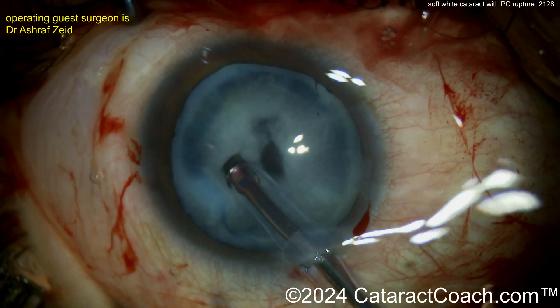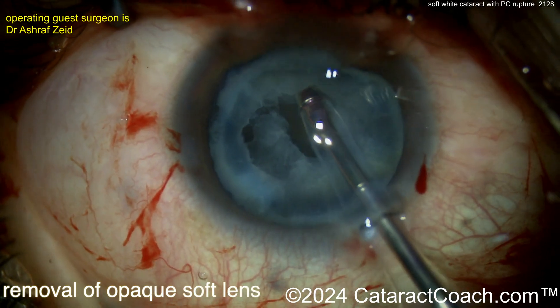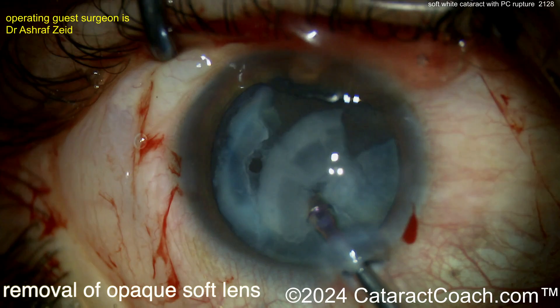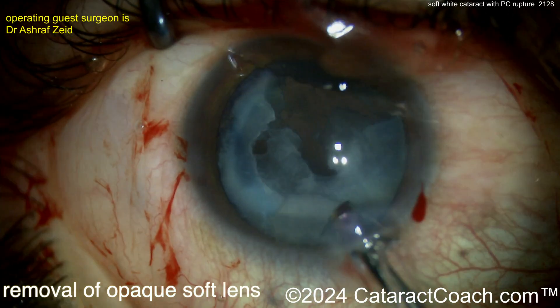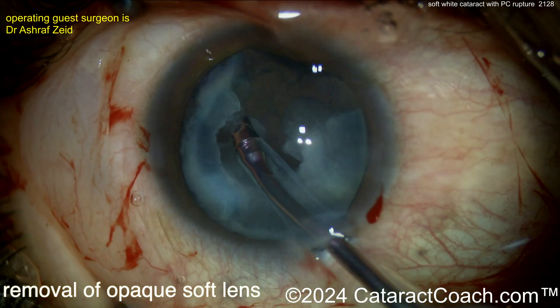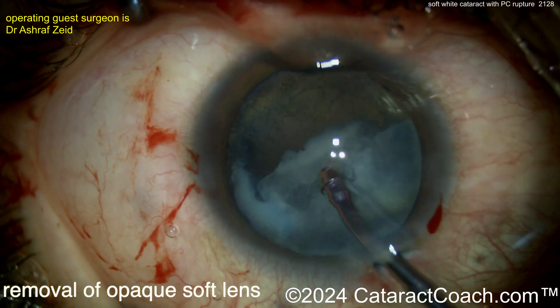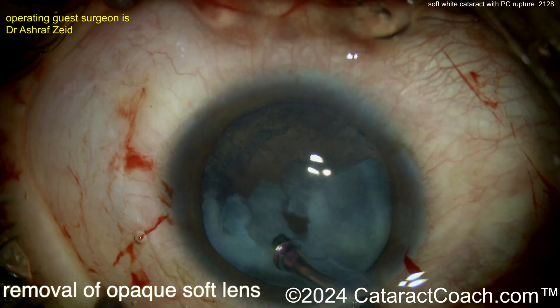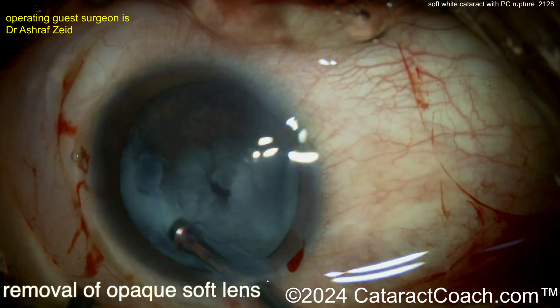Going in here trying to emulsify some of this lens material — note that no hydrodissection was performed, so now this lens can be brought up out of the bag in little pieces. Keep in mind there is a break in the central posterior capsule, so you may want to inject some dispersive viscoelastic through your side port down there to create a bit of a barrier.